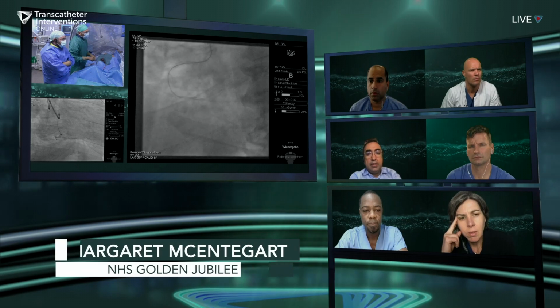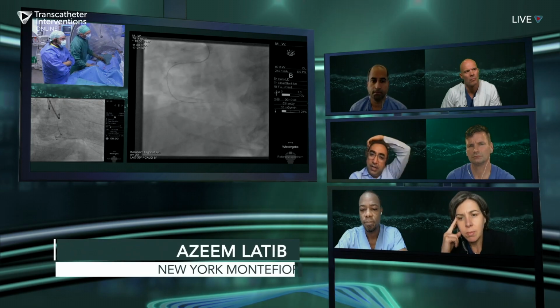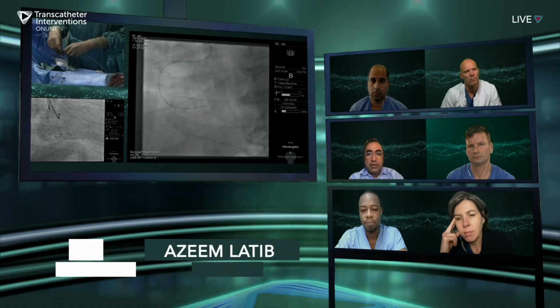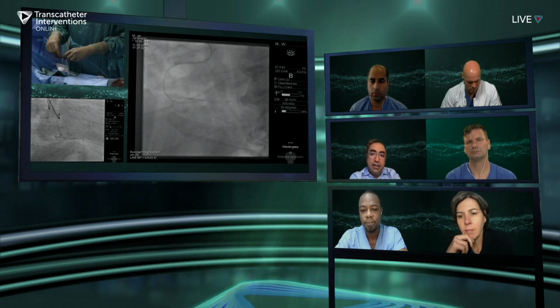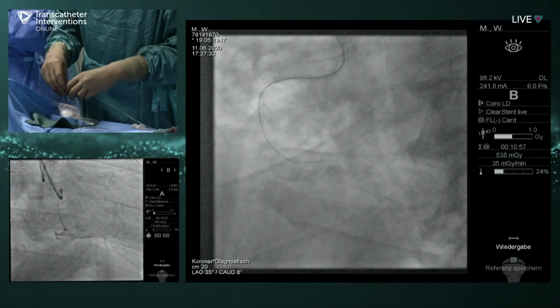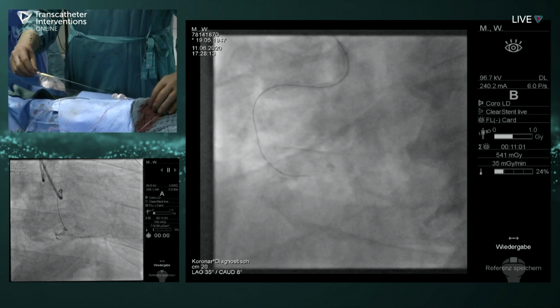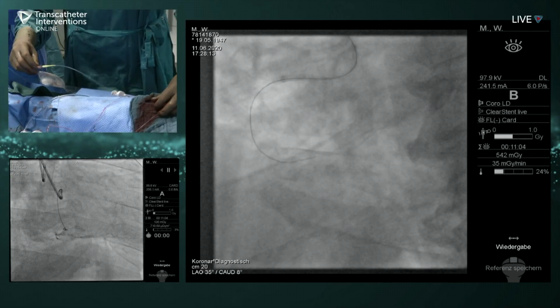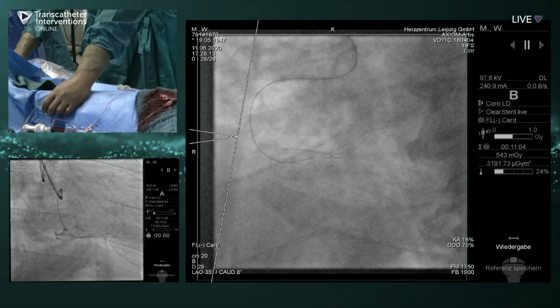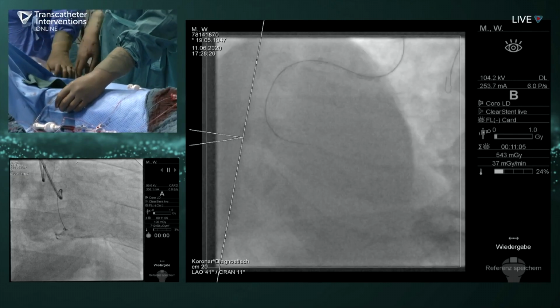Ajay, I don't know about you guys at Columbia, but we've certainly moved away from using Fine Cross when we do antegrade wire escalation. We tend to prefer Turnpike or Corsair, especially when you're struggling, the ability to rotate it and get it more distal, we find is quite useful. Yeah, the spinning aspect, you can kind of spin the Fine Cross, but not as well. But the spinning aspect is really important. We do use Fine Cross if we're going to do septal injections because the lumen's a little bit bigger. But for these types of cases, we're often using Turnpike Spiral or something like a Corsair Pro.